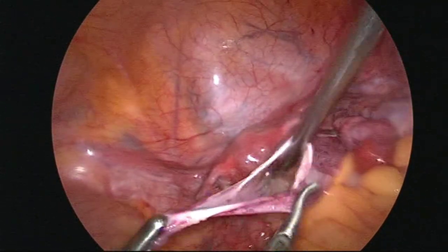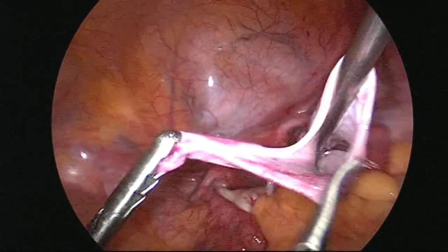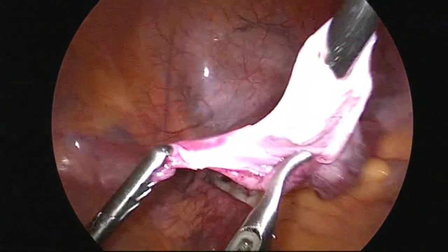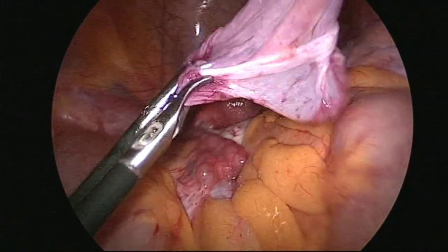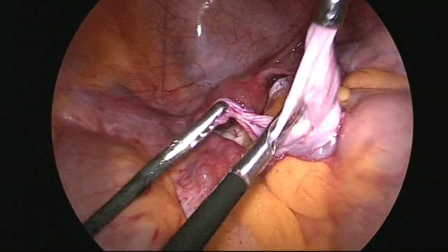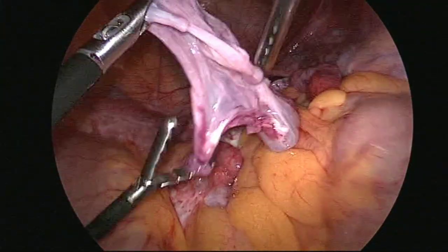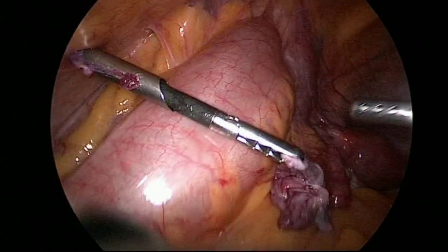And the beauty of the surgery is that it's removed completely encapsulated, so there will be very few chances of recurrence. Now I'll remove the cyst wall through the 5 mm port if I am able to. Otherwise I have to change the camera and remove it by the 10 mm camera port.